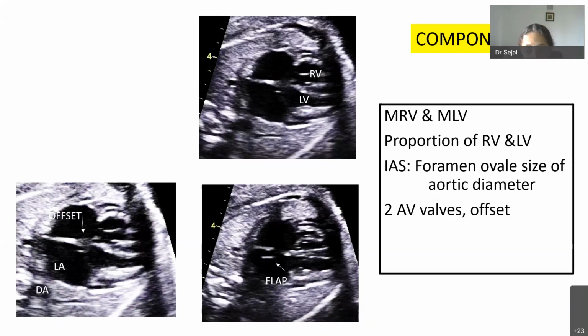The baby is 200 grams, 300 grams. So that difference comes to 1 or 2 millimeters. So it's very, very important to try to make sure that you have differentiated the insertions and it's not in the same plane. As to pick up small primum ASDs and small inlet VSDs may not be possible in fetal life. You will also see the descending aorta behind the left atrium.